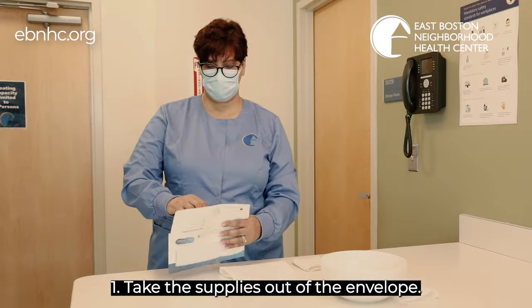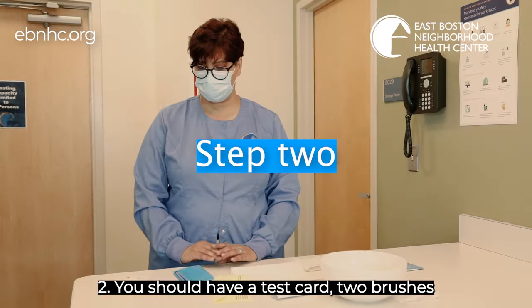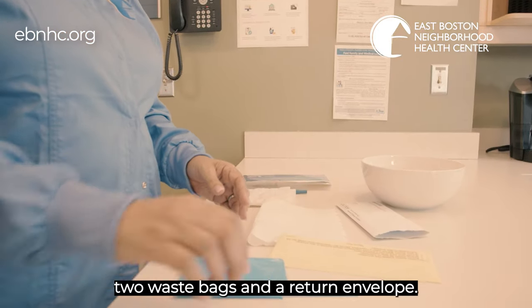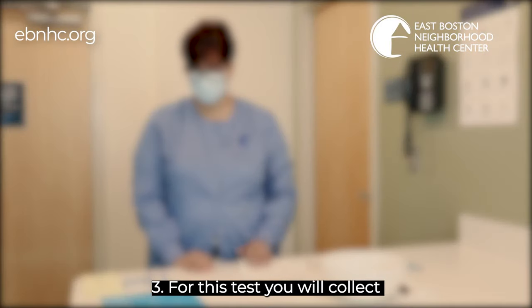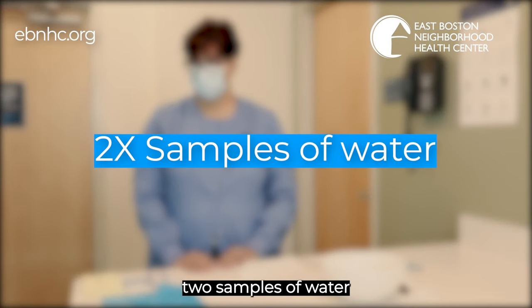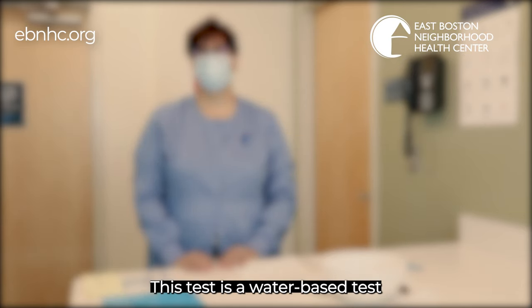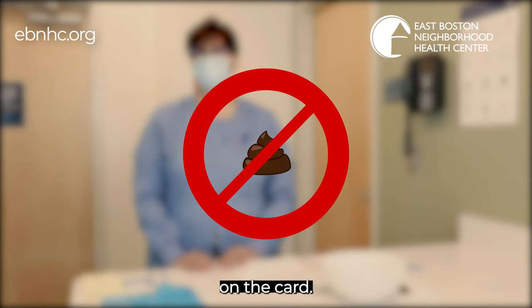Step 1: Take the supplies out of the envelope. Step 2: You should have a test card, two brushes, two waste bags, and a return envelope. Step 3: For this test you will collect two samples of water from the toilet bowl from one bowel movement. This test is a water-based test and you should not put any poop or stool on the card.